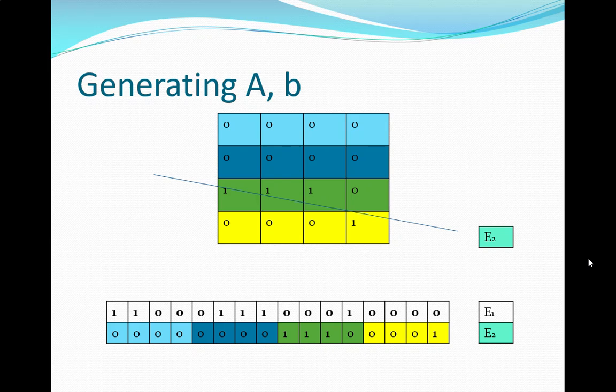So if I multiply by something that describes the stopping power, this is our unknown, times this, if I knew you'll lose so much energy if you touch the first one, you'll lose a different amount if you touch the second one, so on and so forth. You add up all that, it should add up to the energy loss of the overall system. Since we don't know that X that's multiplying these, that's what you're trying to solve for.